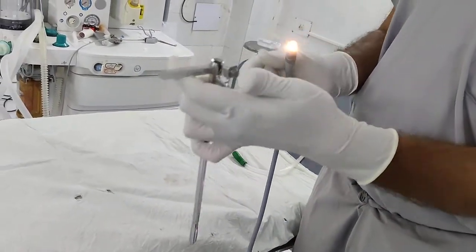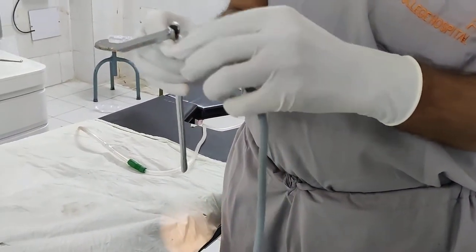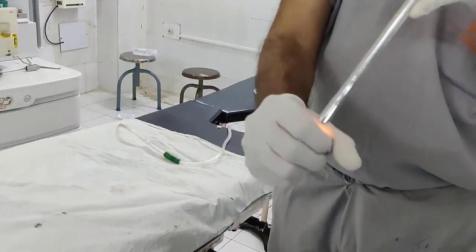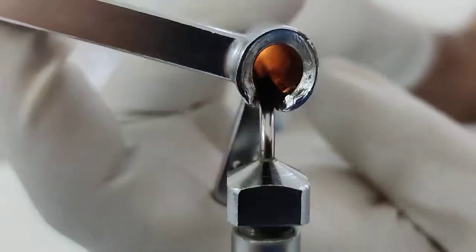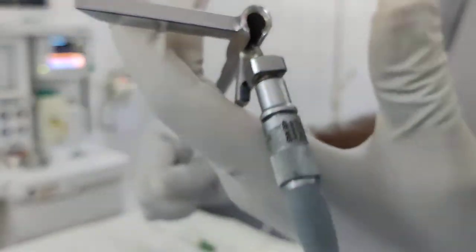You should be holding this in your left hand, or right hand, initially. But once you connect this to the cold light source here, you have to insert it like this and check whether it is functioning or not. Keep it in your left hand and put it in between your fingers — this acts like an esophagus. You have to check it like this; you are able to see inside. Focus on it and keep it nearby; you are able to see the lumen and that way you can examine the things that are there.